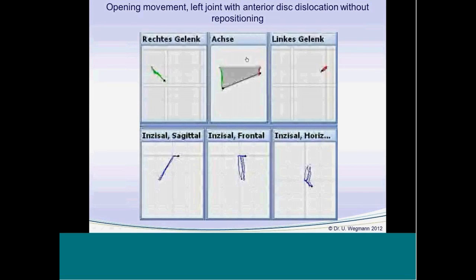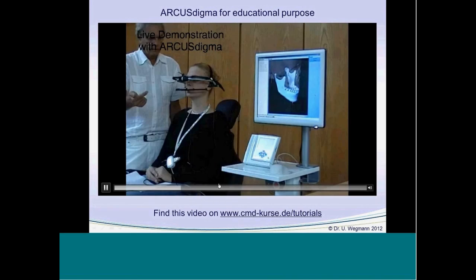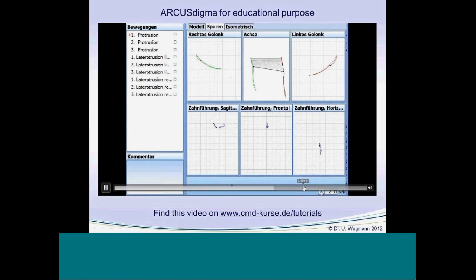You can explain how the function of the patient movements are, and so on. And of course, you can show all these records live in the lecture room, and you can transfer this data to the virtual articulator. I will explain in short now.